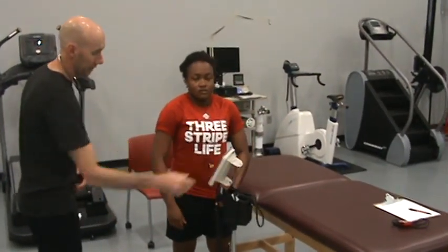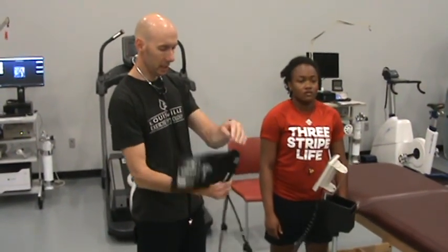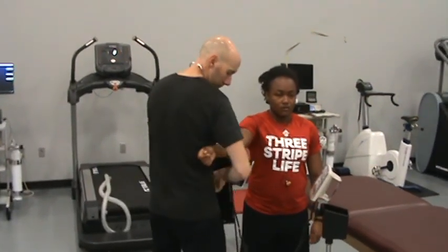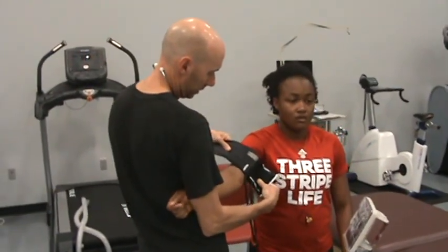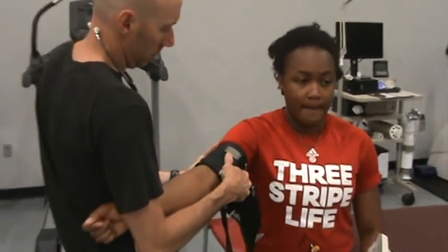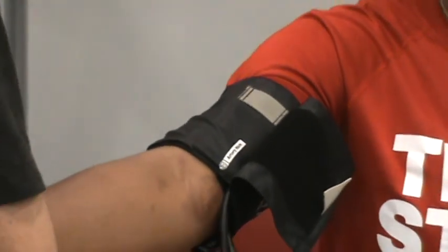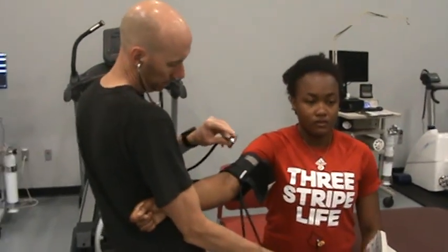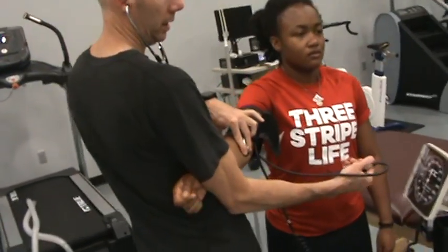So again, I'm gonna go on the right side. And I'll support her arm in a very similar fashion that we did with the last assessment. So I'll just clamp it between my torso and upper arm, place my cuff, make sure that artery mark is lined up well. Okay. Put my stethoscope in my ears, place my bell, make sure it's nice and flat, clamp it with my thumb, and we'll pump up the cuff.